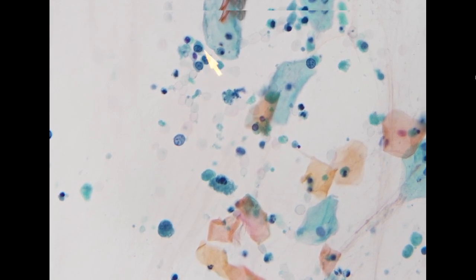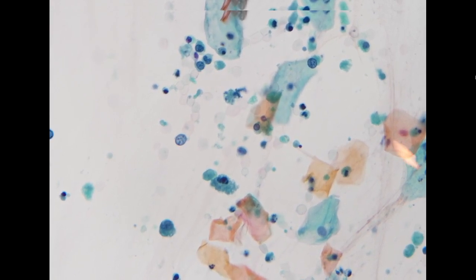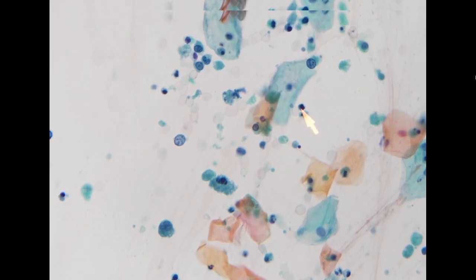However, because we don't see in the clinical note any history that can be attributed to this type of atypia, and indeed it shows hyperchromasia and a high NC ratio of about 0.5, we call these atypical urothelial cells. So this is our atypical urothelial cells.